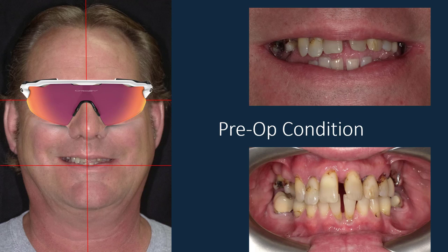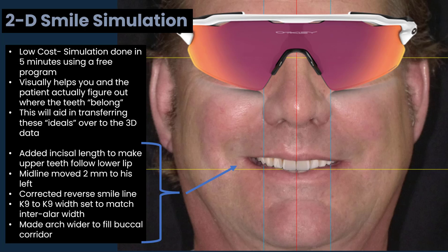Then we can use that to dictate how the 3D wax-up is going to go. Here's a quick example: a patient whose teeth are periodontally involved, they're going to be coming out, lots of diastemas, lots of reverse smile line. We want to figure out what would look good on this patient first and foremost. This is a simulation done in GIMP, which is a free Photoshop alternative.